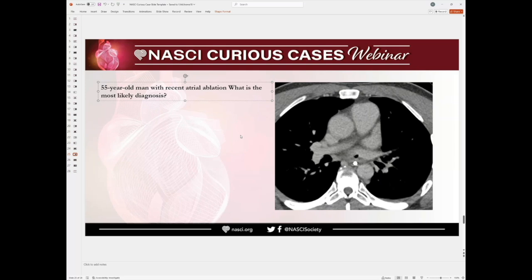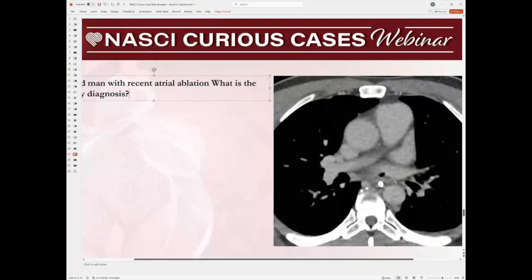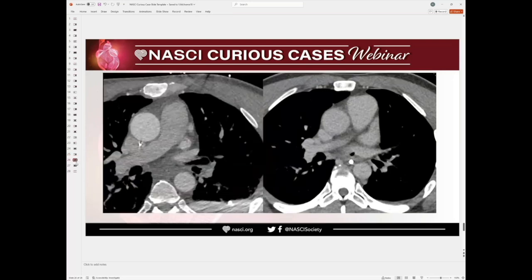Yeah, that's definitely true. But you know how scary it is. At least for me, seeing just a gas bubble within the left atrium is your only chance to catch it on chest CT. When you're scrolling up and down fast, you may miss it. And that's why I'm so scared of this whenever they're asking about atrioesophageal fistula, because the findings sometimes are very subtle.